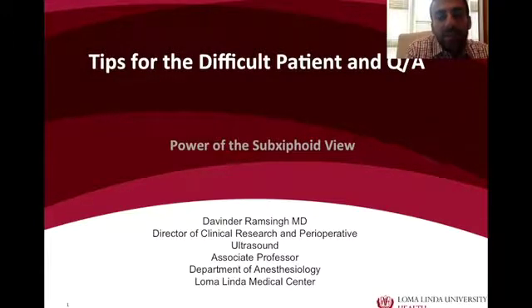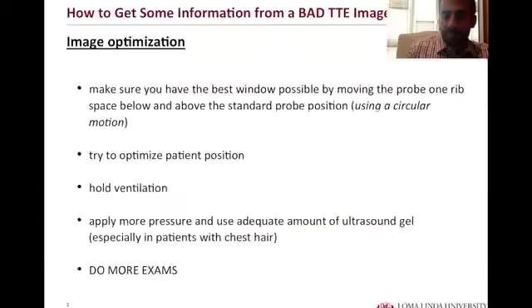And additionally, the subxiphoid view can be very powerful when you're in the ACLS situation where chest compressions are under play, and you would not be able to have access to the chest in that manner. So let's talk about it.